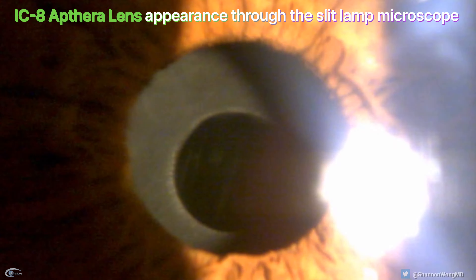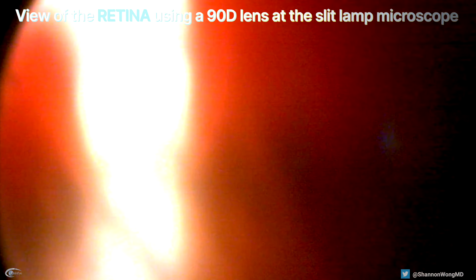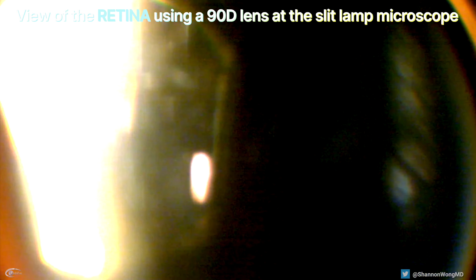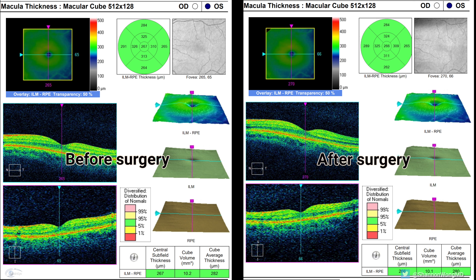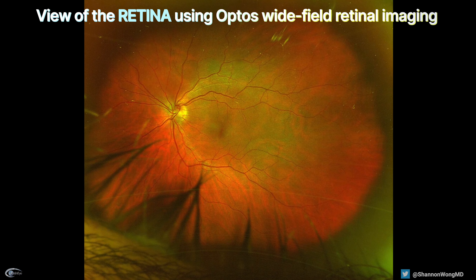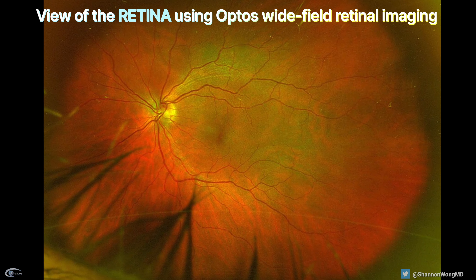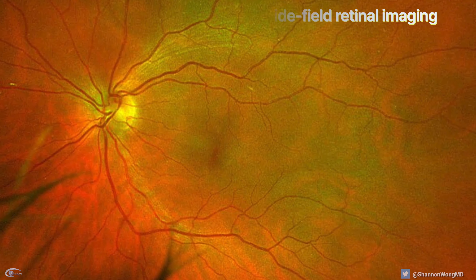So what does the lens implant look like through the slit lamp microscope? Here is our initial view. How clear a view of the retina can we obtain using a 90-diopter lens through the slit lamp microscope? How does an OCT of the macula appear through the natural lens and through the IC8? How does an OCT of the optic nerve appear through the natural lens and through the IC8? In an undilated pupil, how does the view of the retina appear through the IC8 lens using an Optus California retinal imaging system?